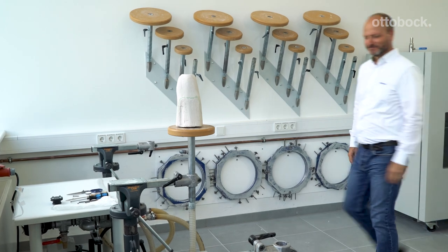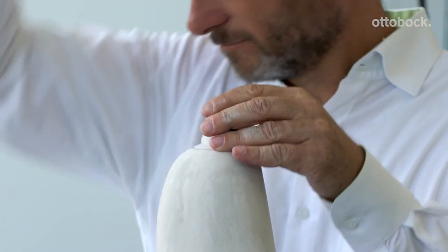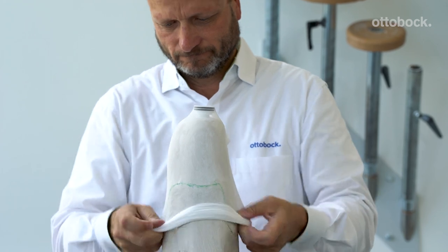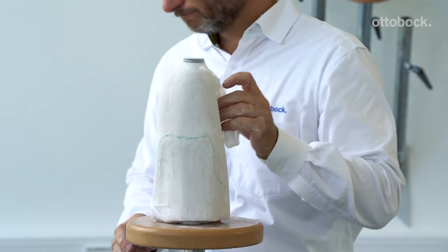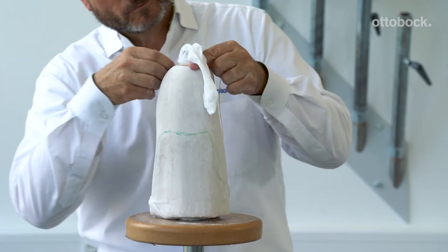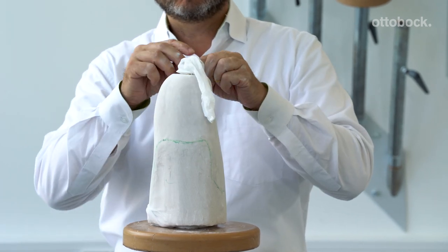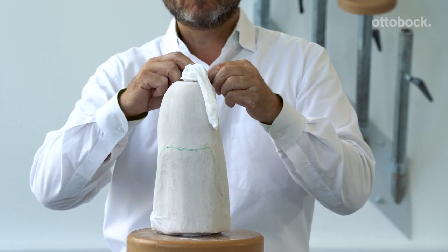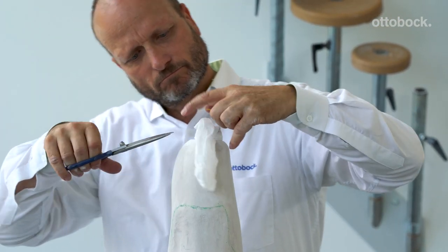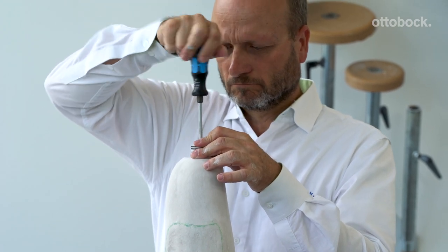Now Kai will demonstrate preparation and fabrication of the check socket. Anchor the piston dummy loosely with a screw. Take a thin nylon stockinette and put it over the top of the plaster model and the piston dummy. Then take a small thread and tie off the nylon stockinette underneath the piston dummy and around the screw. Trim off all the excess nylon stockinette to expose the piston dummy, then finish securing the piston dummy to the plaster model.